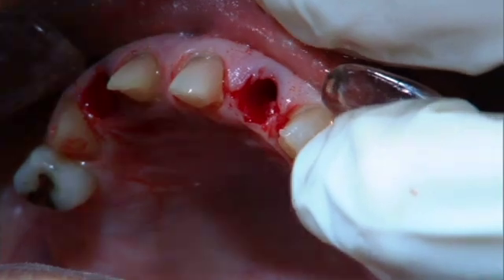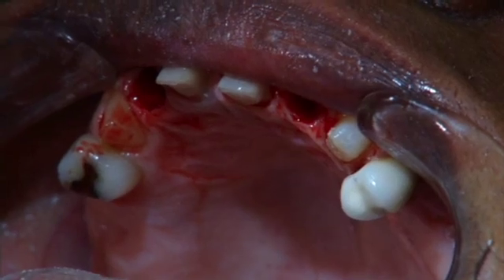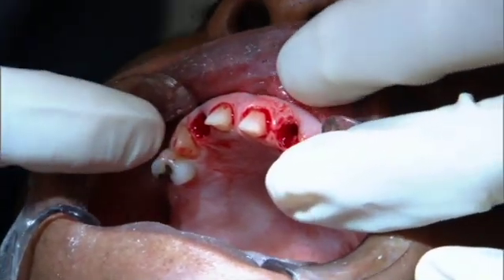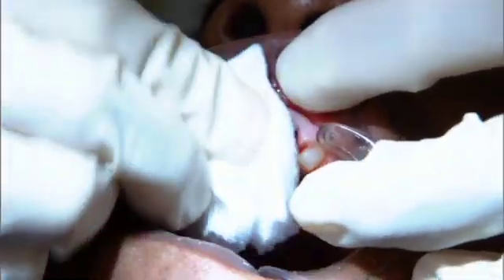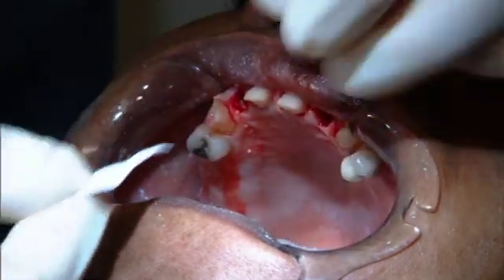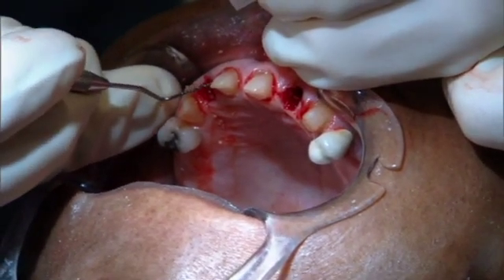We'll put this aside, and one of my goals now is to graft these two socket holes. What we're going to use is LifeNet bone, freeze-dried decalcified bone, and Kathy has mixed that bone and rehydrated it with just a little bit of anesthesia, and we mix some tetracycline powder in with the bone. To graft the sockets, we're going to use BioGlide, which is a barrier membrane, and we're going to use a technique that Dennis Tarnow has come up with called the keyhole approach.